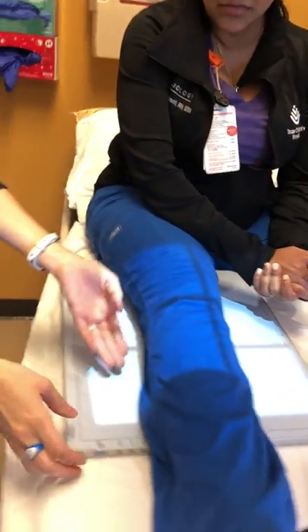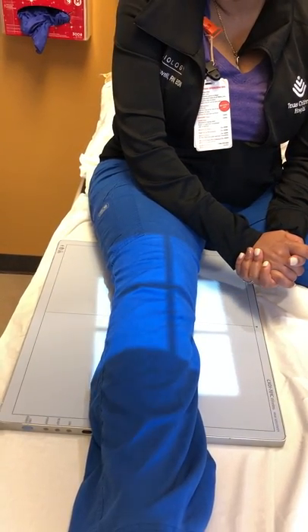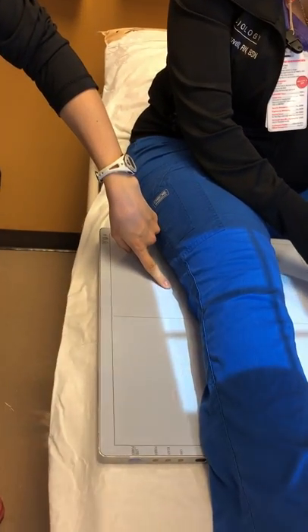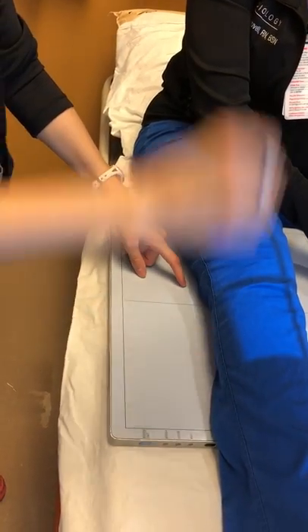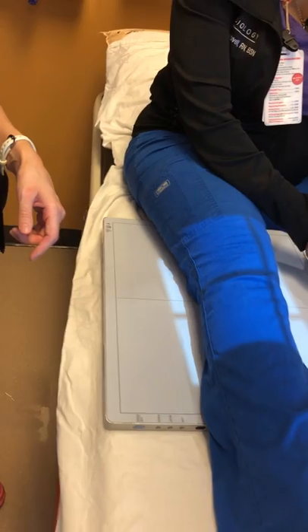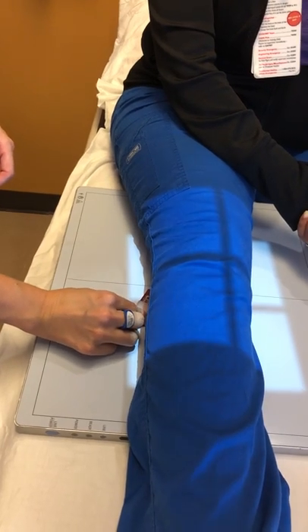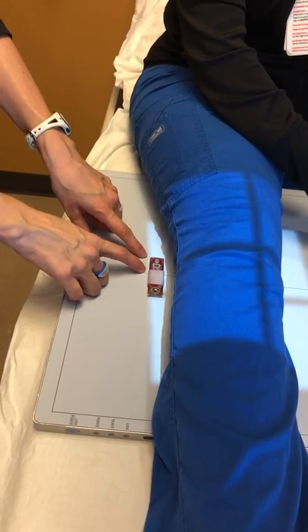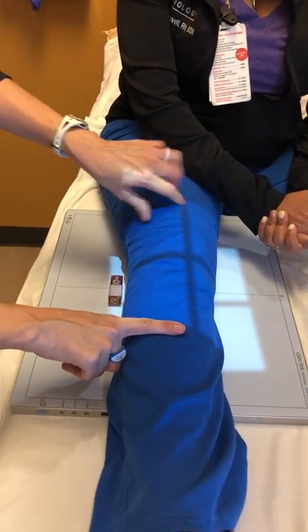Your collimation should be brought down to the margins of the skin. Leaving it wide open is inadequate and inappropriate collimation. You also don't want to collimate too tight and clip anatomy. Make sure you include all soft tissue structures but nothing excessive. Place your marker on the outside, not into the area of interest — keep it outside of the soft tissues and within your collimation margin.